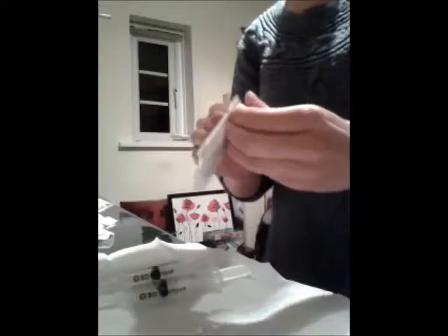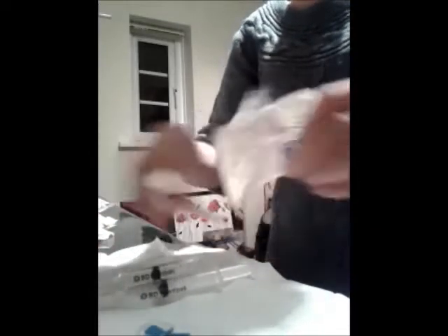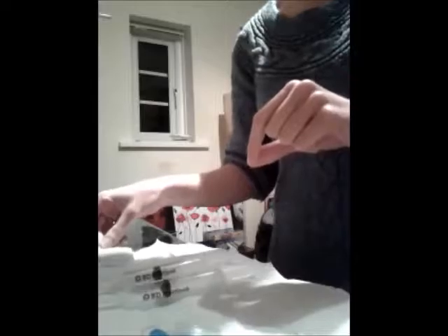Next, I always unpack the butterfly needles — these are the ones I use for the actual infusion itself. Take those off, take off the plastic cover, but always leave the stopper on. The next bit is I need to get one of my sterile wipes because I have to use this on my actual bottle of immunoglobulins. I do take 6g of this, which is equivalent to 30ml. So I do 15ml in each site, and I do 2 sites.